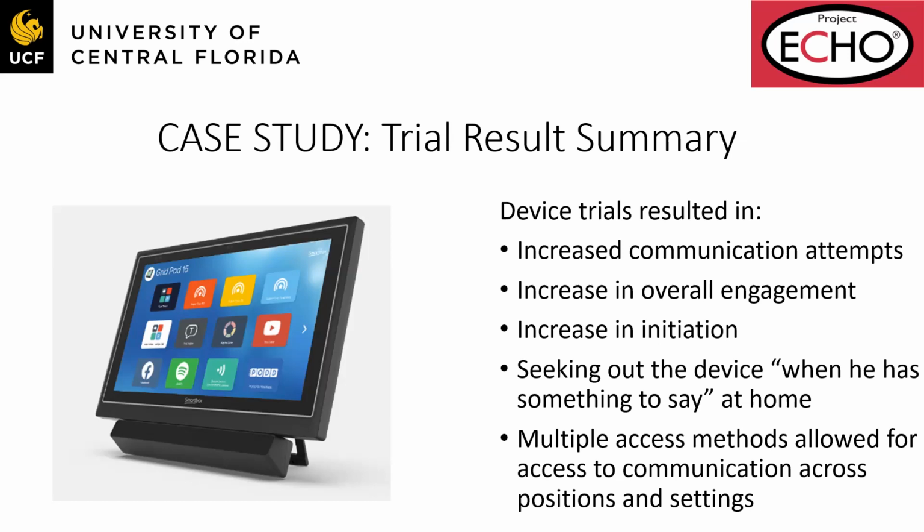We were expecting him to become a 2-switch scanner, and he did, but he also started communicating with his eyes a whole lot more too. So we proceeded with going to purchase through insurance.